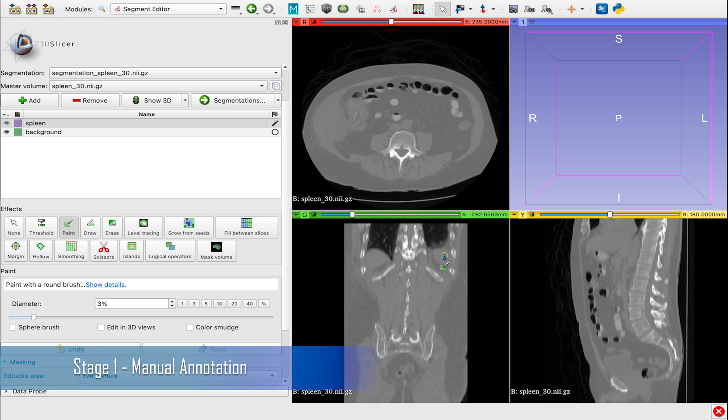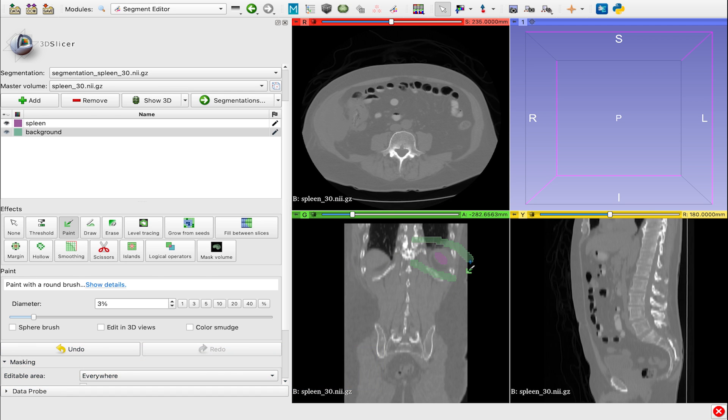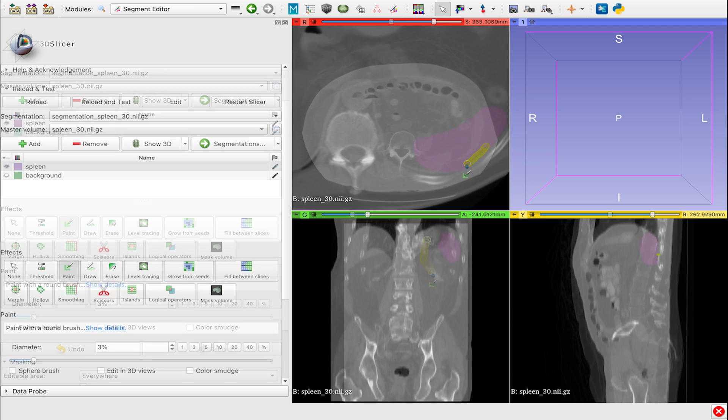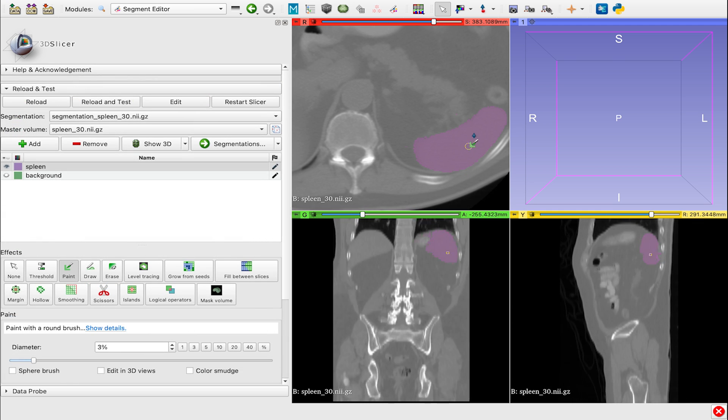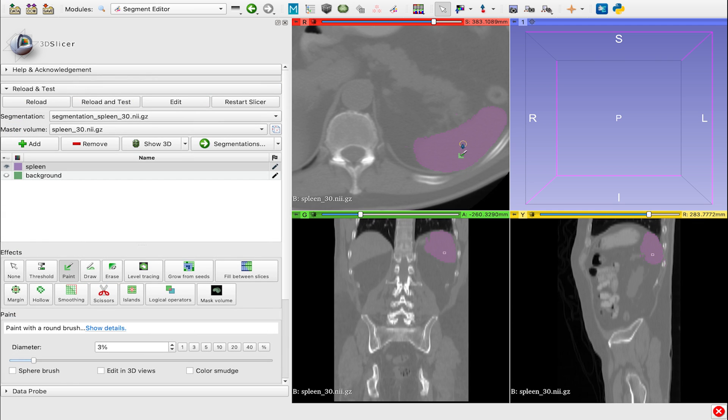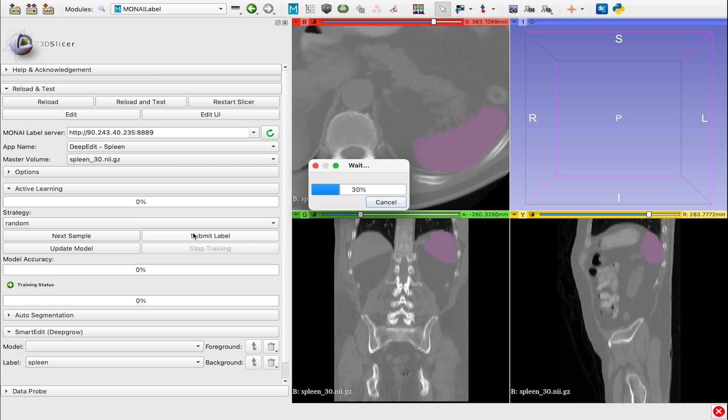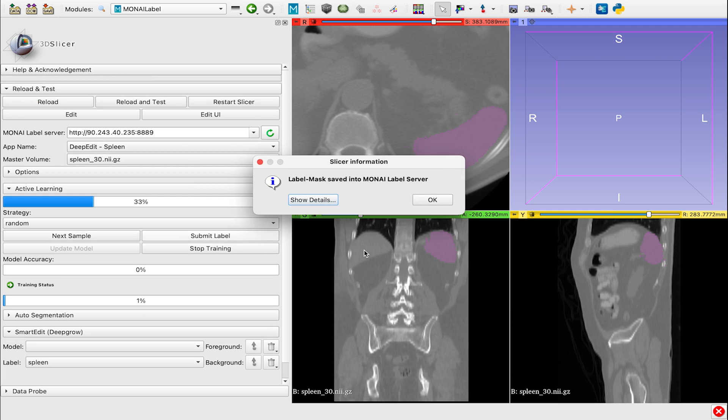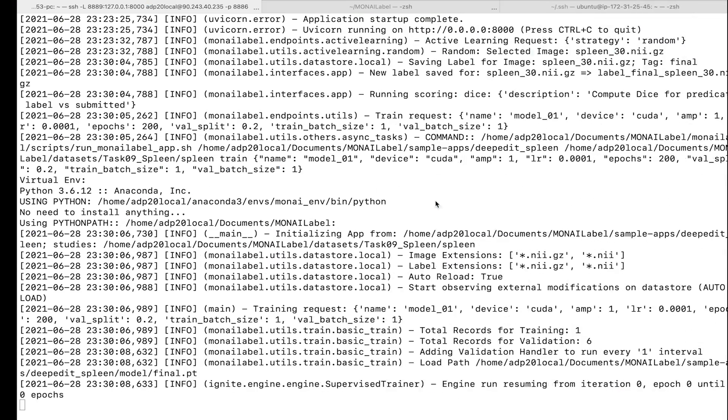Stage 1: We start by annotating a few images to get our initial model started training. In this example, we used a contour-based annotation tool, which takes about 12 and a half minutes for a single image.